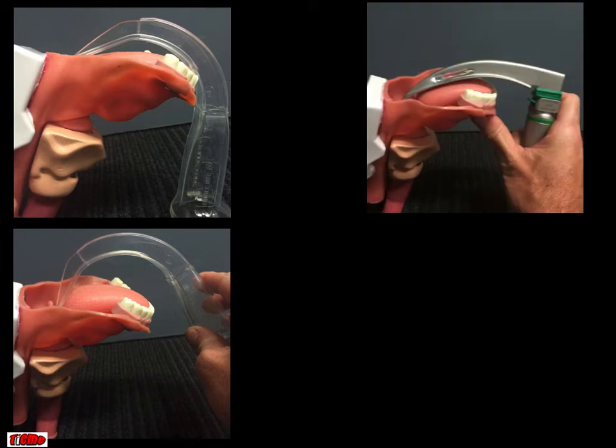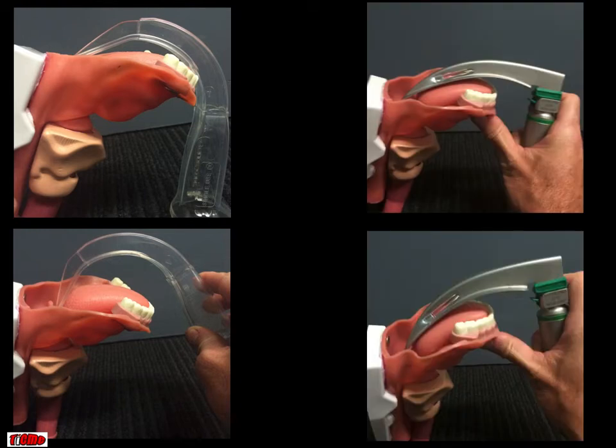If you look at a Mac blade instead, when you lever there is far more surface area being applied even if you do lever, and so the chances of damage, I think, is less.